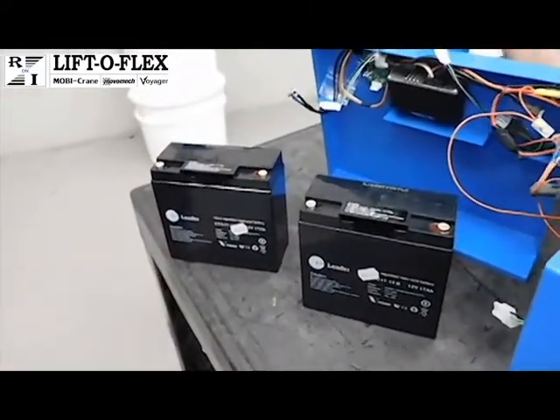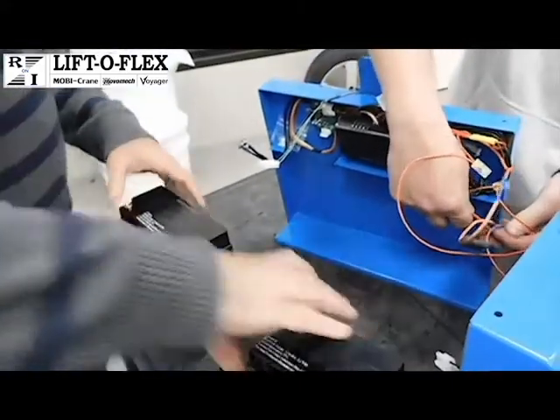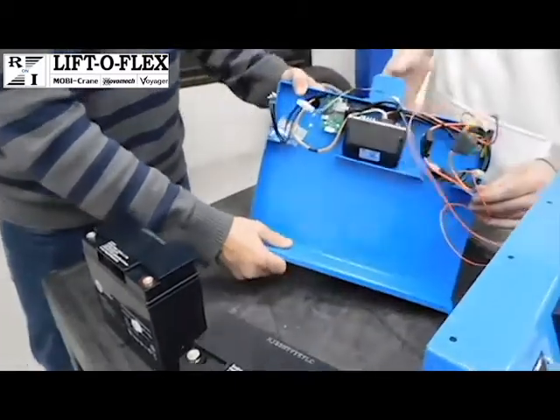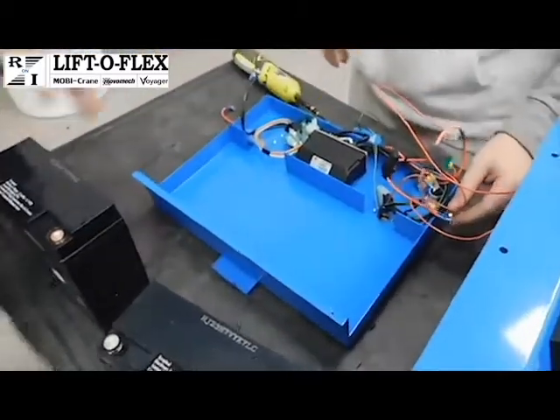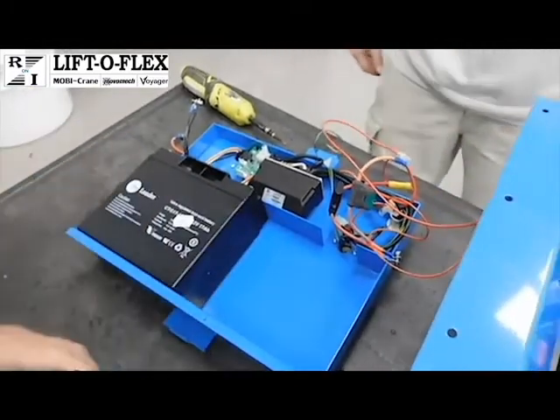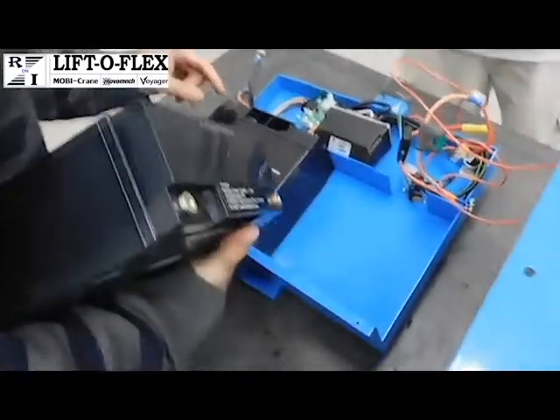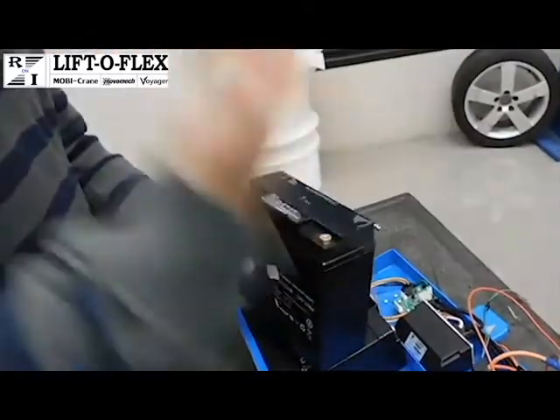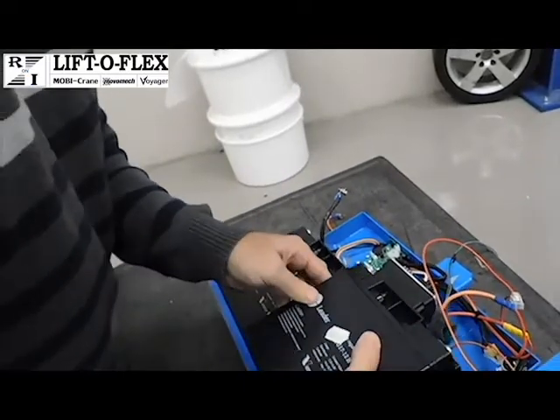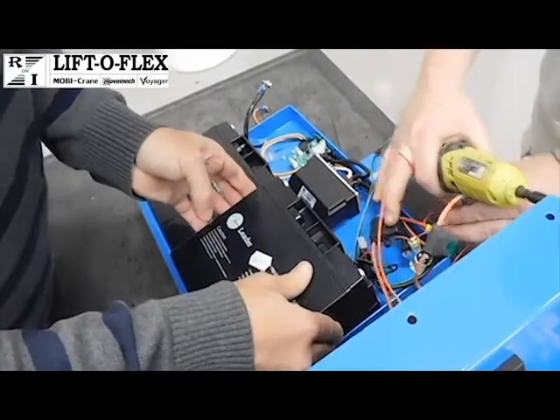We'll now show insertion back into the power pack. Inserting the batteries is done easier with the power pack sitting down. Please note the orientation of the leads. So the terminals are always to the outside of the power pack with the positive on the right. And make sure you don't catch any wires when putting the batteries back in.